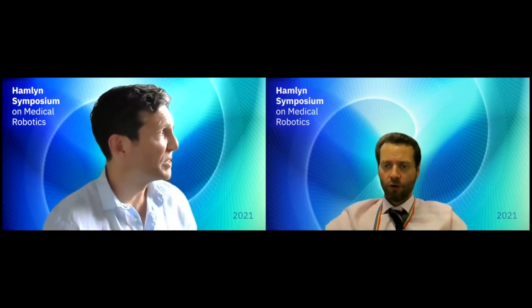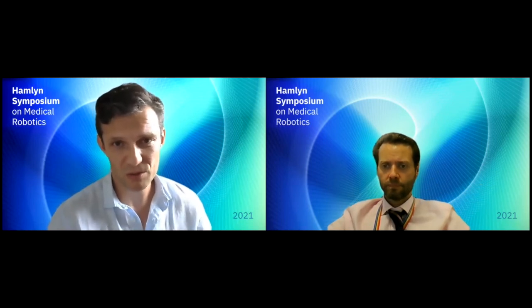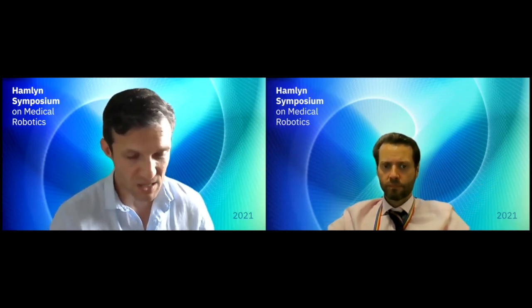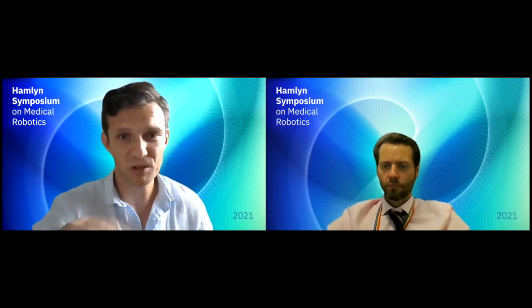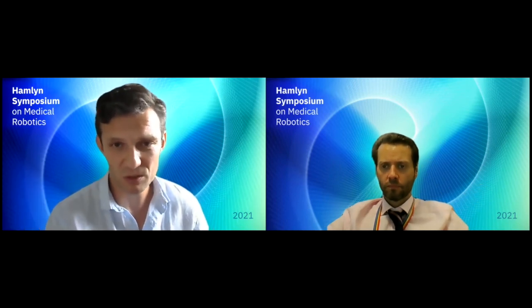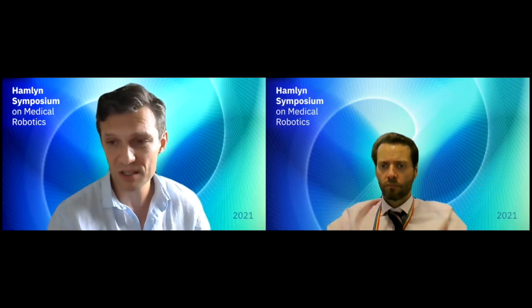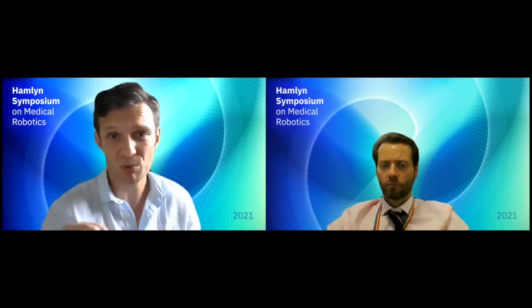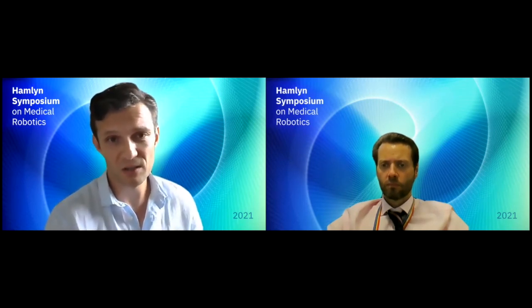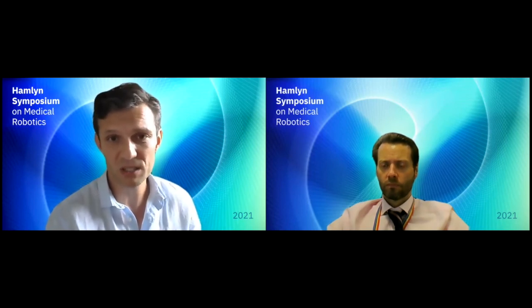Yeah, because the challenges are, if you go for supervised learning, getting the right data. There's no beautiful 3D data to do supervised learning. The other challenges are how do you do domain adaptation, so that if you're suddenly in a different part of the anatomy, how do you make sure that your system is going to work? But I think those are interesting challenges to work on. I know that this year at MICCAI, there is a challenge purely on the domain adaptation problem, which I think is really exciting. So with data-driven methods, that would be one of the big things that we still need to tackle.